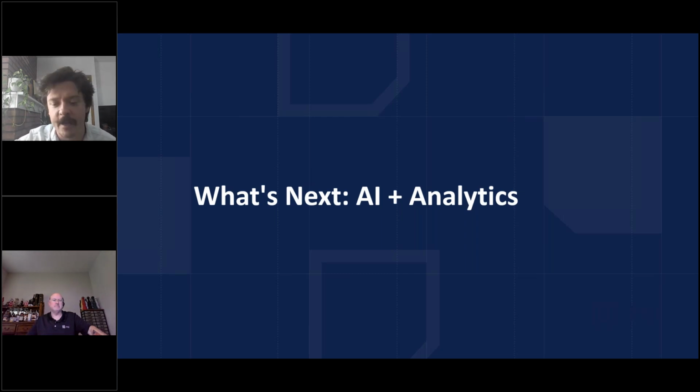And beyond the analytical side of things, imagine a world where you're a technician doing rounds and you realize that there's something that needs a work order now, and you submit a technician request to replace an asset or repair an asset. And instead of having to go onto an iPad and fill out a whole form, you can leverage the location data and the camera on that iPad to take a picture and then say, hey, CMS, create a work order to repair this asset. And then that LLM can interpret what you're saying and realize, okay, I need to fill out this data based on location, et cetera, and you have a work order there in seconds as opposed to the 3 or 4 minutes that it might take you to fill out a full complete form with notes and everything else.